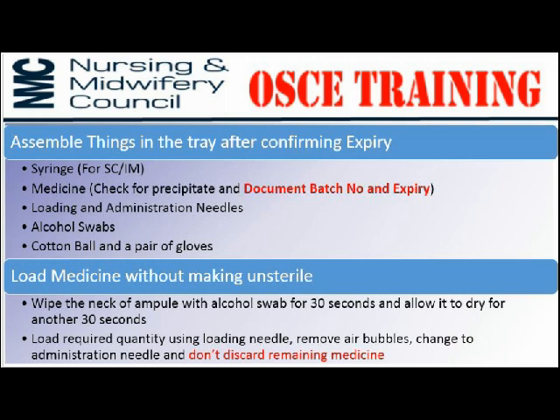Next, you have to assemble the things in the tray after confirming the expiry of each item. You need to have a syringe for the subcutaneous or IM injection. Then you need to have the medicine. While taking the medicine, check for precipitate, and document the batch number and expiry of the medicine. Then you need to have loading and administration needles.